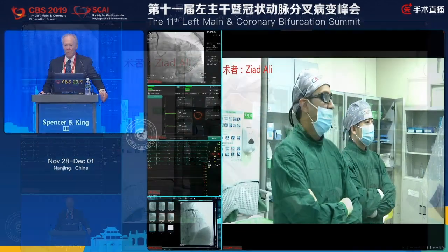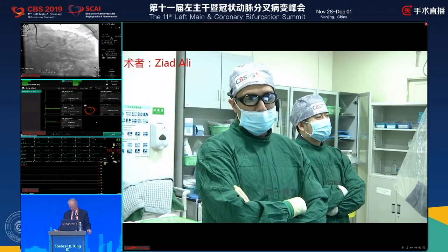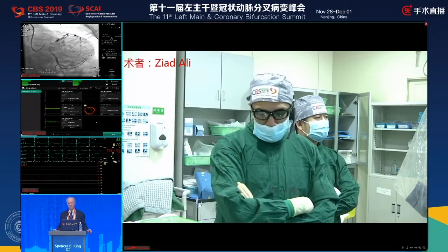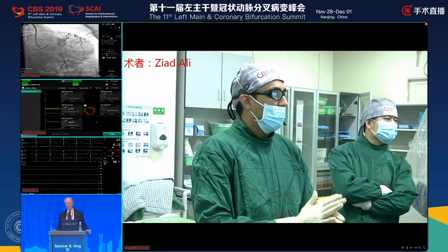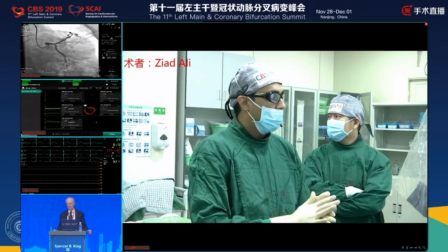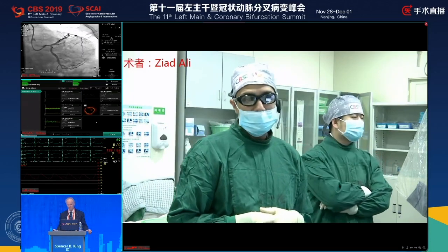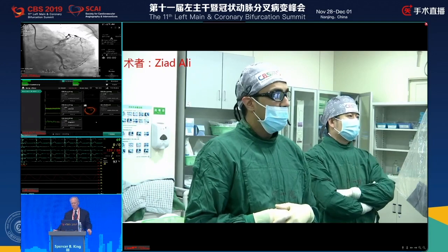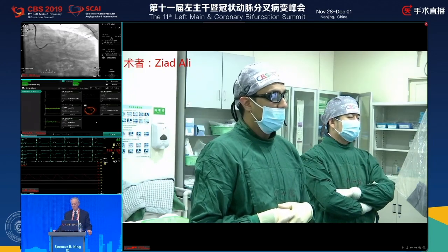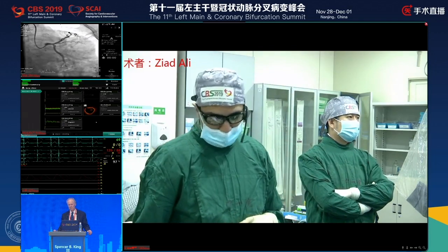So we're going to punish you and indulge you with a lot of technology. So what we decided to do was to use a new Angio-FFR system by RainMed called caFFR, coronary angiography FFR. We correlated that directly with an invasive pressure FFR. And we've also done an OCT to look at the plaque morphology of the LAD and found that the culprit lesion does in fact, well, we'll let you know in a second.